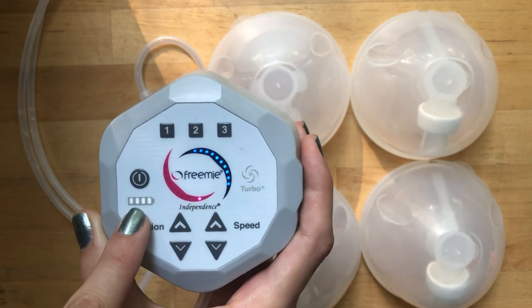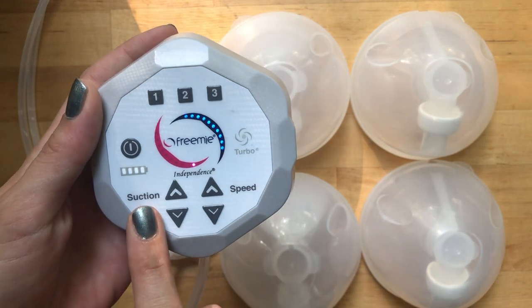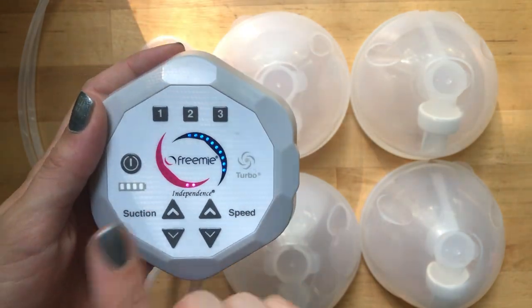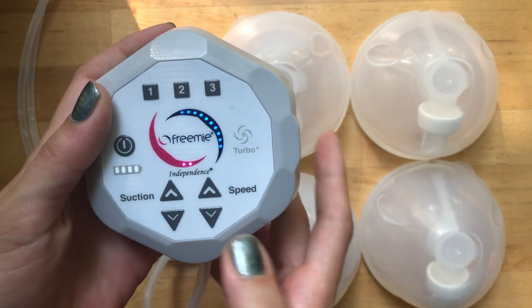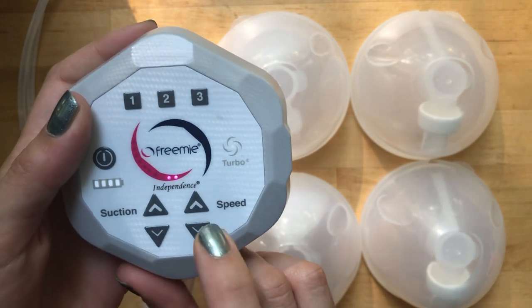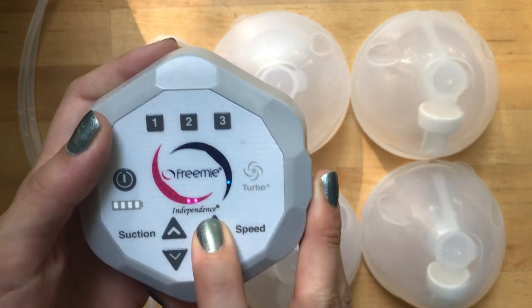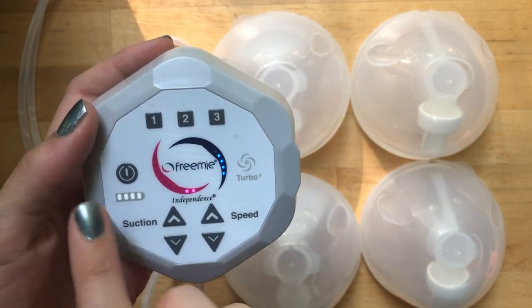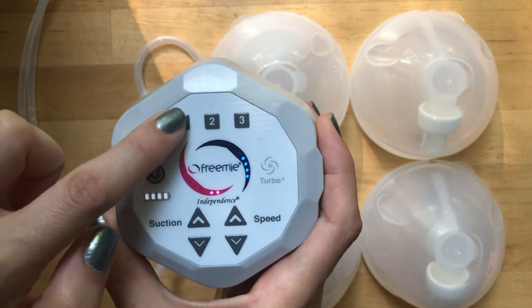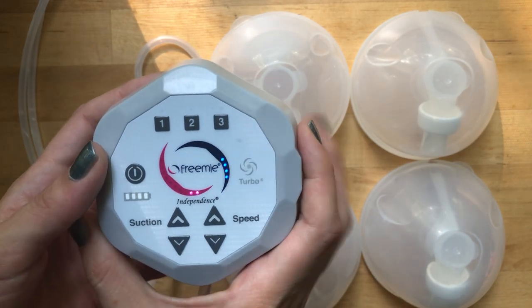It's got a power button and a battery indicator so you can tell when it needs charging. It also gives you options for suction and speed that you can turn up or down to whatever you're most comfortable with. If you turn the speed all the way down, there's a little turbo light that I believe is similar to a letdown mode on other pumps. If you find settings you like, you can save them by pressing and holding these buttons, so you can easily revisit them without even looking at the pump.